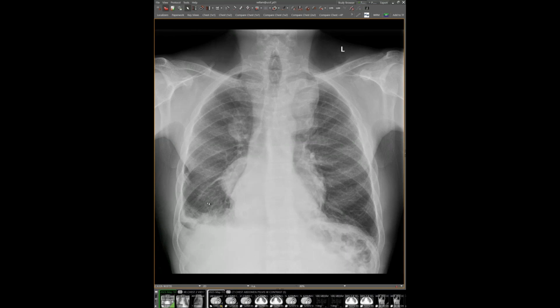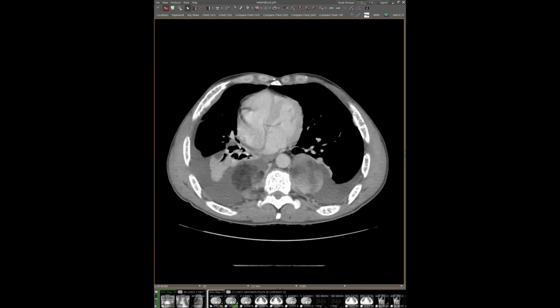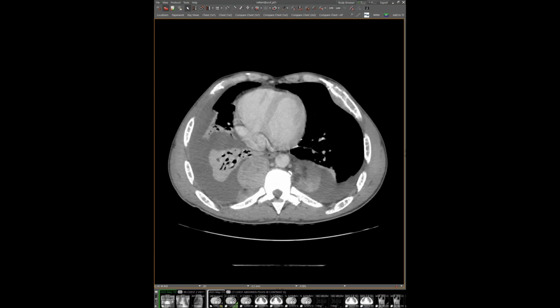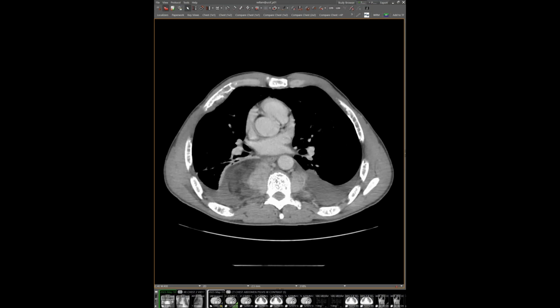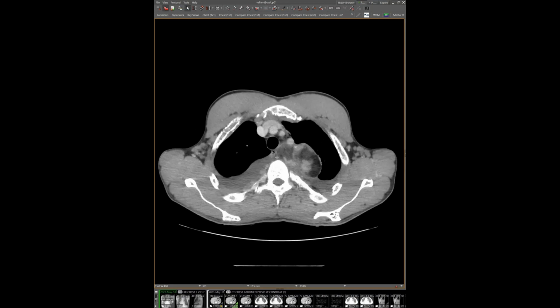Yeah, great case. I have a question for you now, thinking about this. If you need to make blood cells in other places and you do so like this, what is it about the fact that there's fat there? Why do we have fat in these lesions? And quite a lot in this case. Because fat's not the problem, blood cells are the problem. But that happens frequently. Does anyone have any sense of what it is about the process that sometimes there's a lot of presumably just plain old adipocytes there?